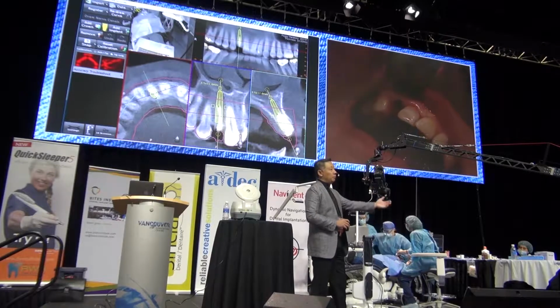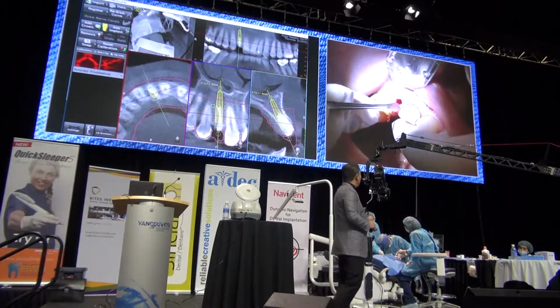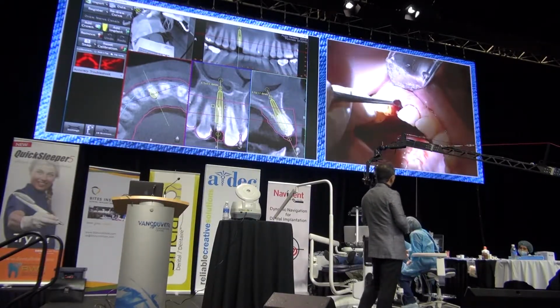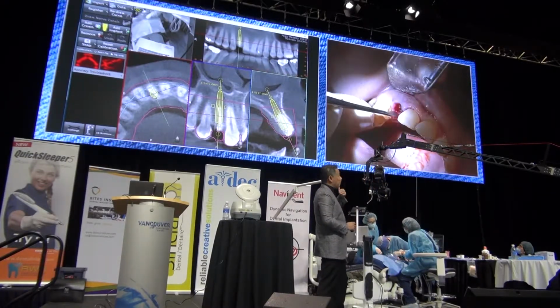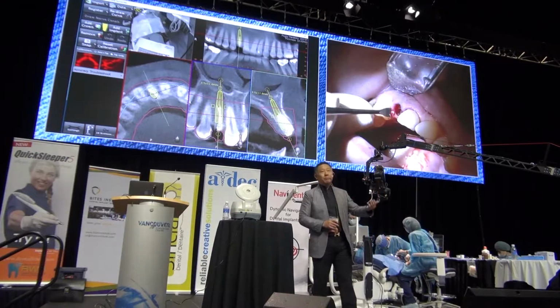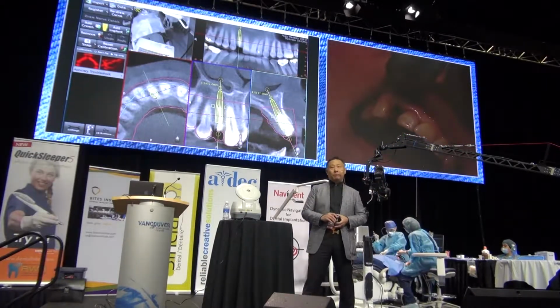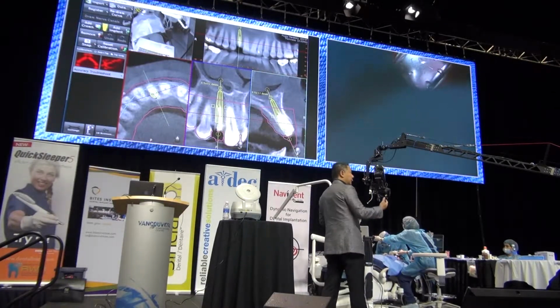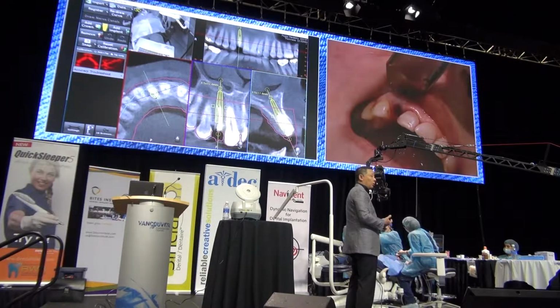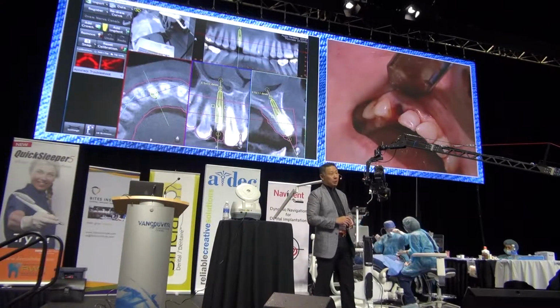There are post-insertion studies out there with robust data to show that from your implant to the buccal plate, we need a minimum of 3 millimeters of bone. As such, with a good hard and soft tissue biotype, it seems to give us the most predictable long-term prognosis and outcome.